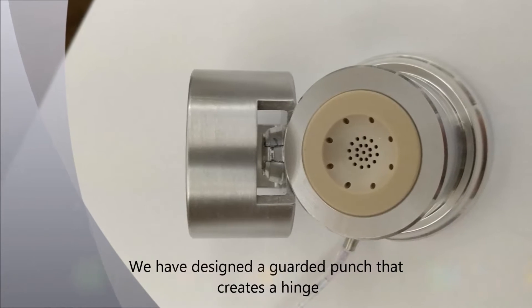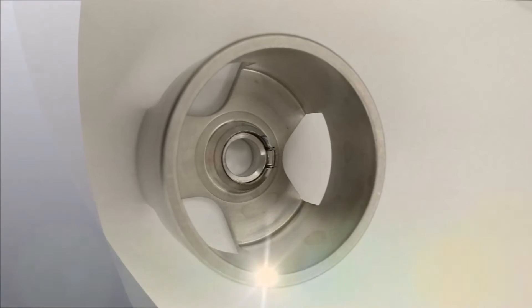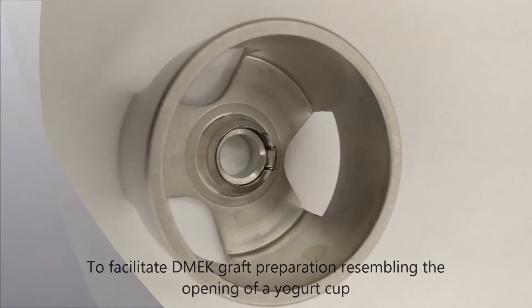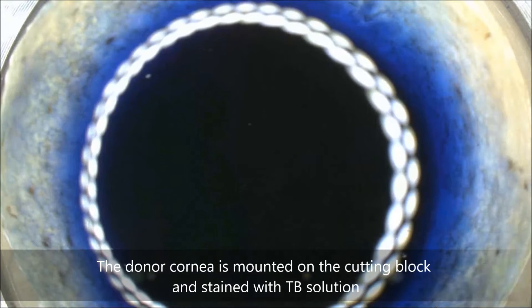We have designed a guarded corneal punch that creates a hinge in order to facilitate DMEK graft preparation, resembling the opening of a yogurt cup. The technique is quite easy and straightforward.